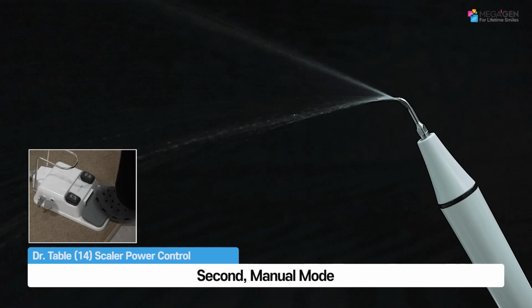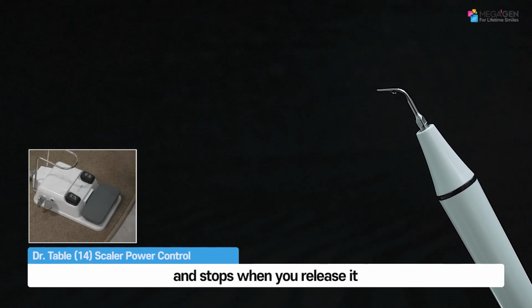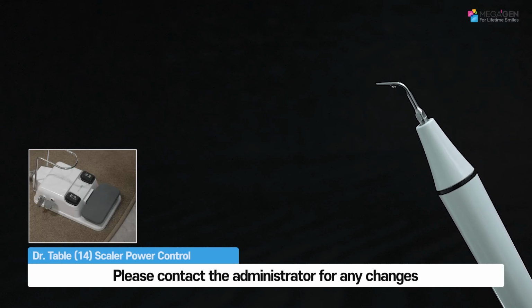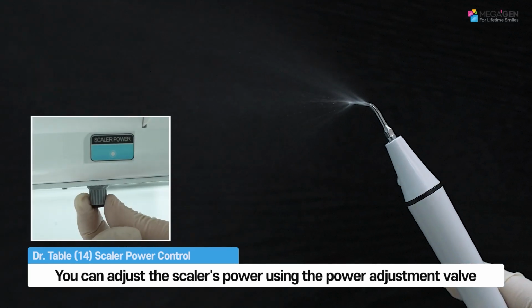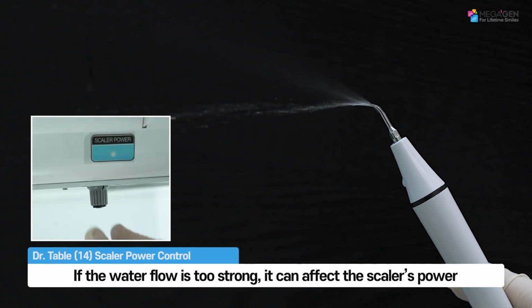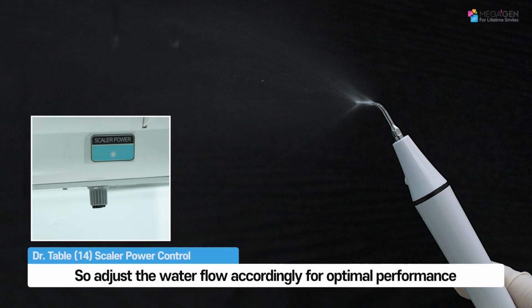Second, manual mode. The scaler operates while pressing the pedal and stops when you release it. The default is auto mode. Please contact the administrator for any changes. You can adjust the scaler's power using the power adjustment valve. If the water flow is too strong, it can affect the scaler's power, so adjust the water flow accordingly for optimal performance.